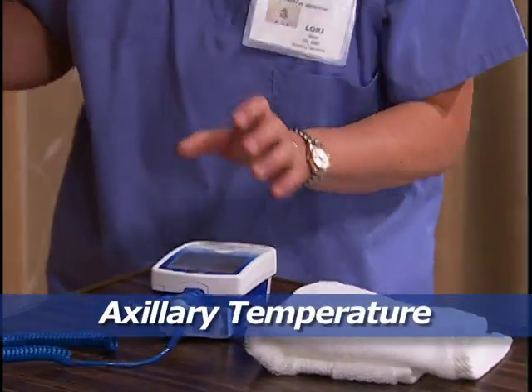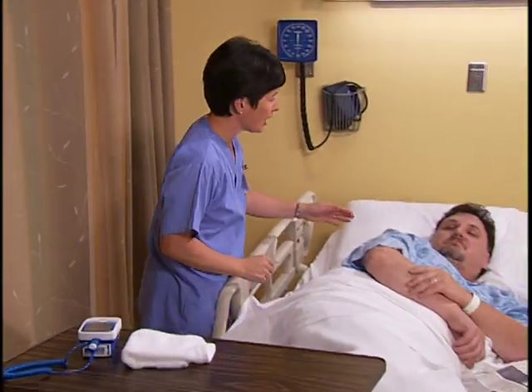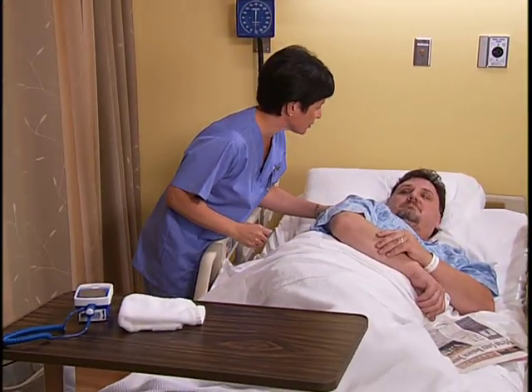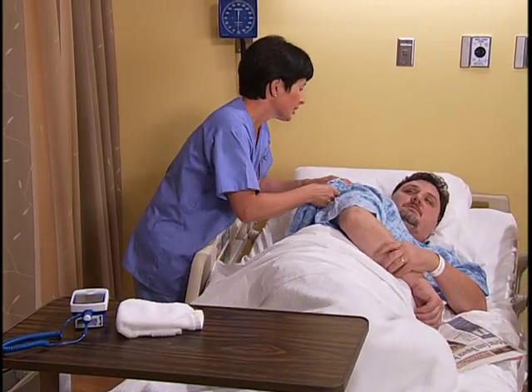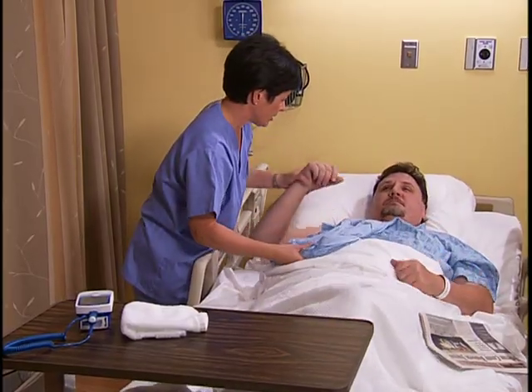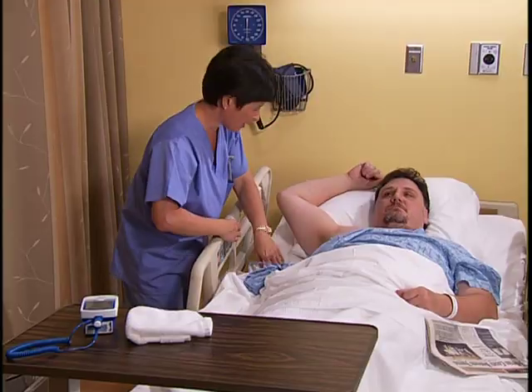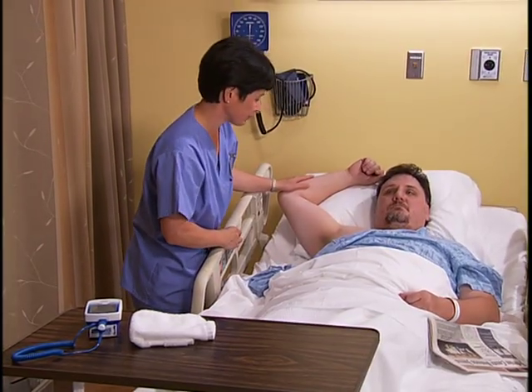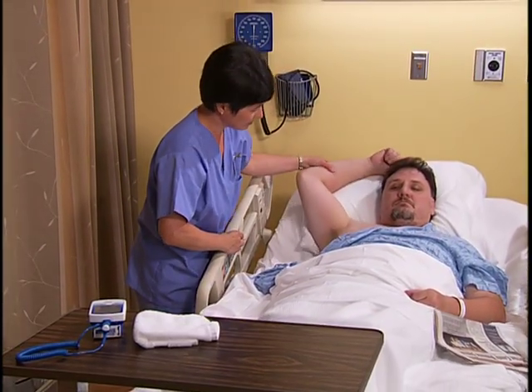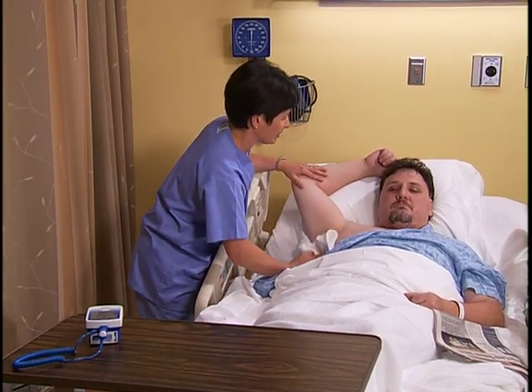For an axillary temperature, ensure the patient's privacy. Good morning, Mr. Otten. I'm going to check your temperature this morning. How are you feeling? Pretty good. Can you turn on your back? Move his gown away from his shoulder and arm. Put your arm up for me. Help him into a supine or seated position.